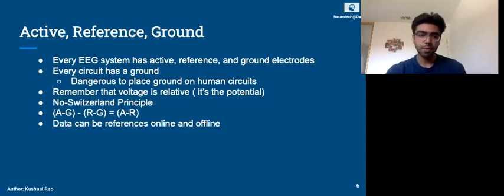So what usually happens is that an EEG system creates a virtual ground, and we have a ground electrode that is connected to that ground circuit. And that problem is kind of solved there. There's a lot more nuances and honestly a lot more technicalities, but for all intents and purposes, that's pretty much all you need to understand about that at this point.